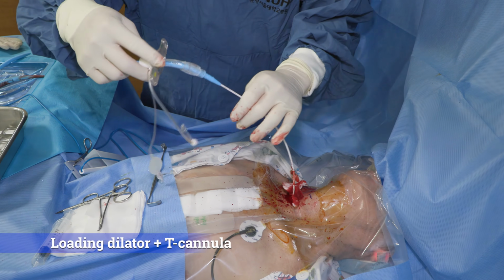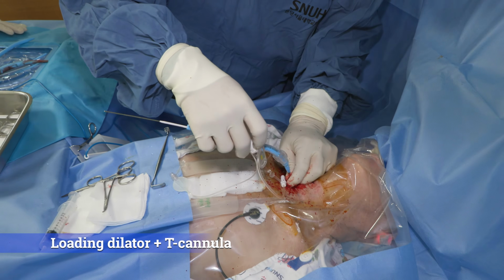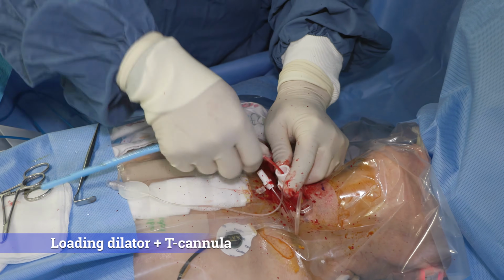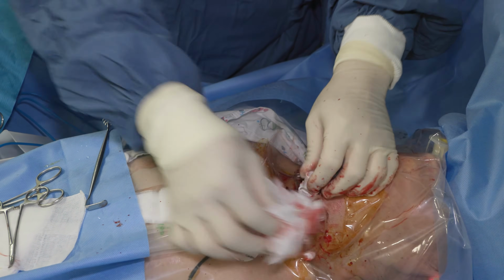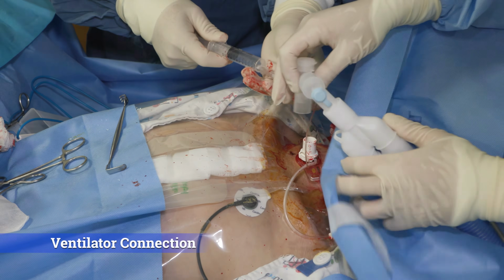Subsequently, the loading dilator and T-cannula, pre-assembled together, are advanced along the guiding catheter into the trachea to insert the T-cannula. Before this step, both the loading dilator and T-cannula should be well lubricated with jelly. At this point, the endotracheal tube is completely removed.